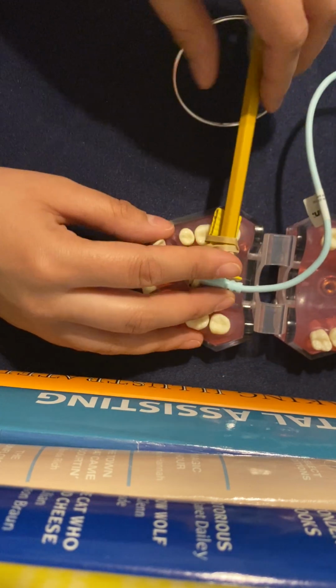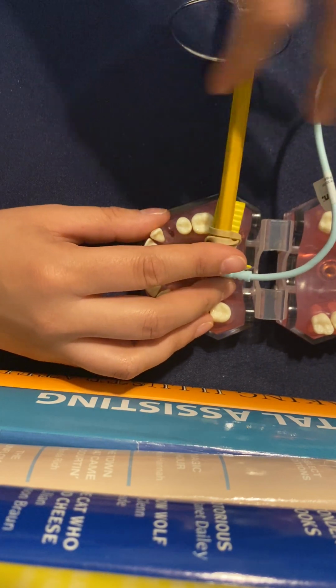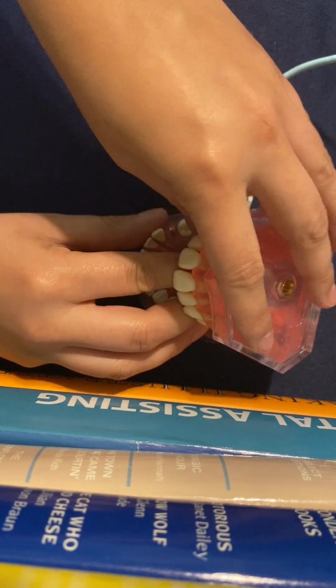Sorry, Kim, if that's wrong. So try to get it in there. Bite down.